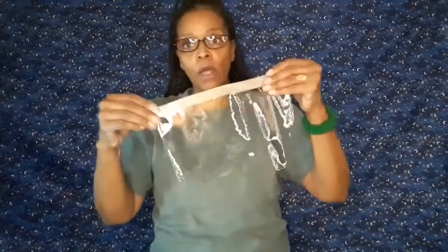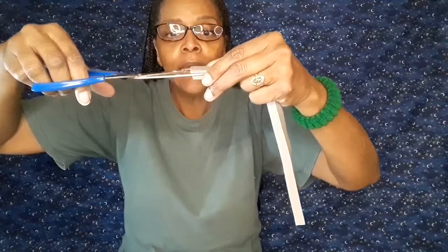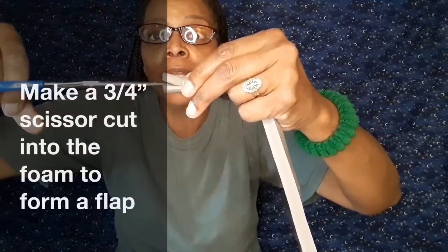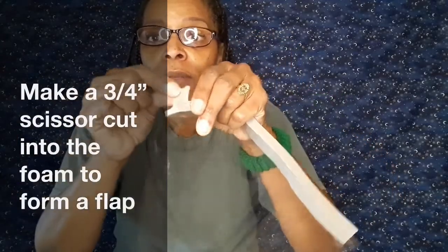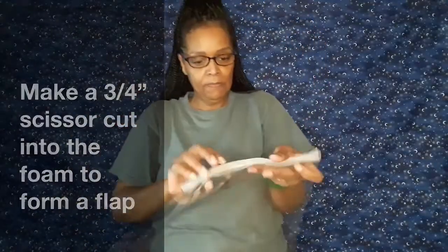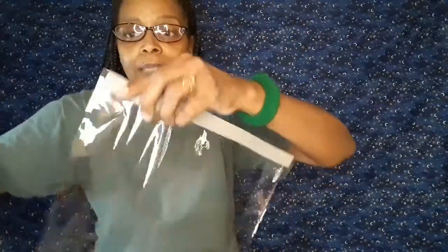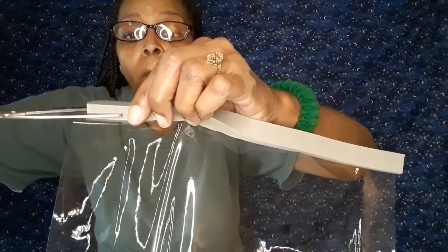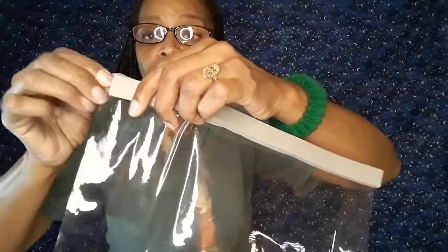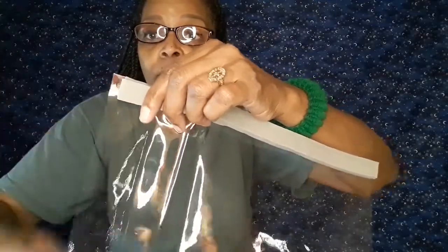So I have this on. My next step is I take a pair of scissors and I just cut in half, just cut it in half right in here, and make this little kind of a gape thing. I do that to both sides. And as you can see here, I've got a little bit hanging over, which I will trim up later on. Okay, so I've cut both sides.